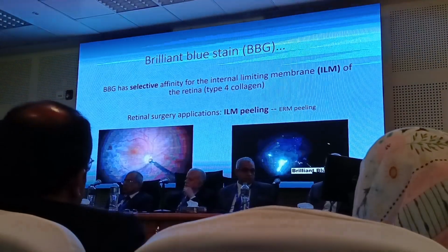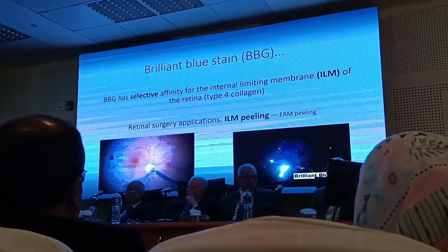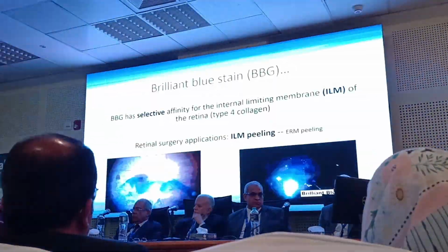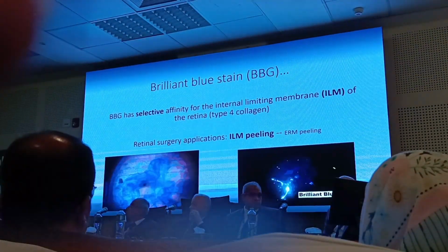The BBG, or the brilliant blue stain, has selective affinity for the internal limiting membrane, type 4 collagen. It stains mainly the ILM. That's how it's put under fluid, and this is under air.